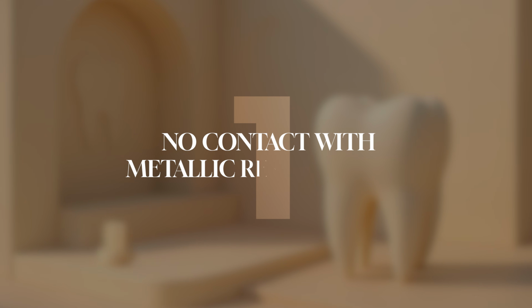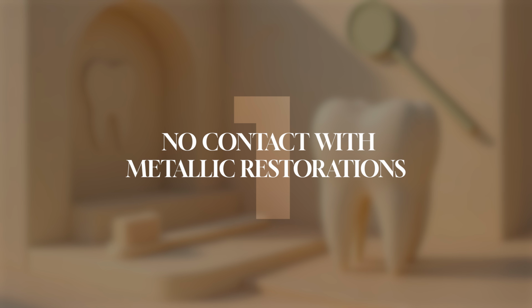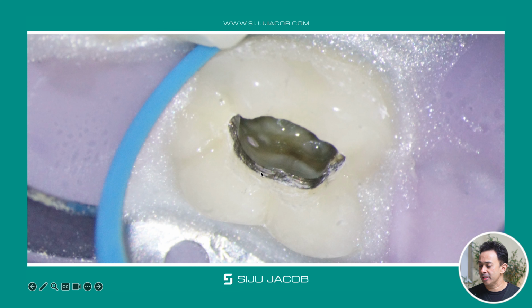The first protocol that we need to follow when we are using an apex locator in clinical practice is to avoid contact of the file with metallic restorations. When we say metallic restorations, it can mean metal ceramic crowns like these, where the metal is exposed while doing the access cavity, or it can even be silver amalgam restorations.